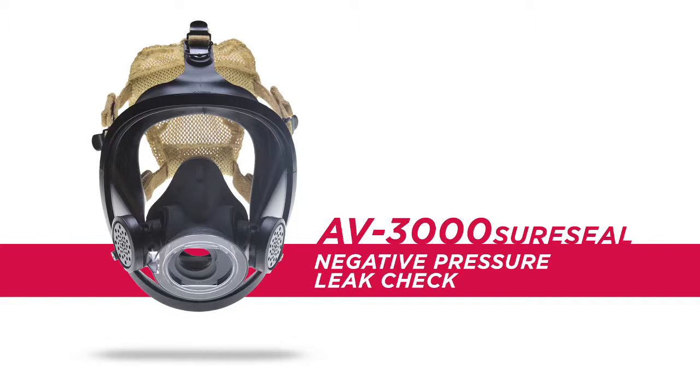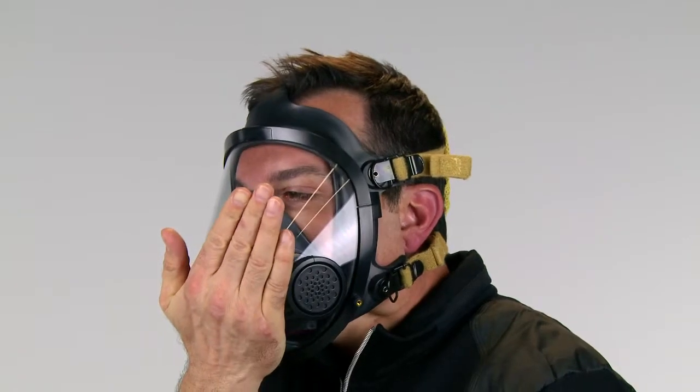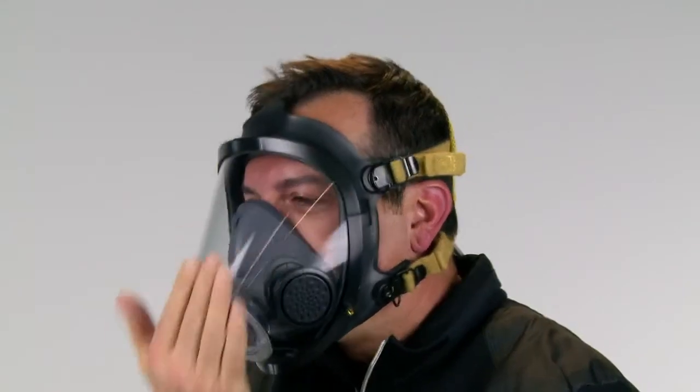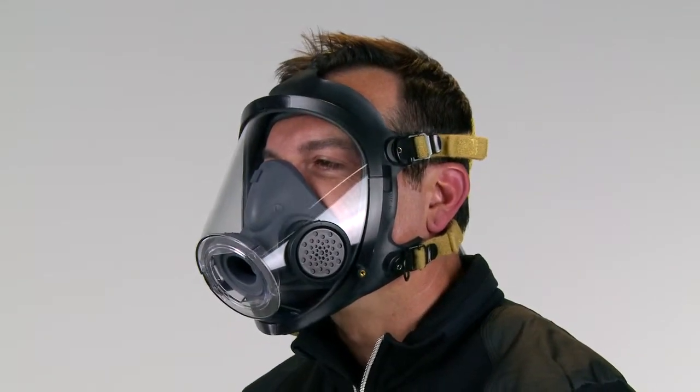Once the facepiece is donned, you are ready to perform the negative pressure leak check. Cover the front opening of the facepiece with your hand to stop ambient air from entering the facepiece. Inhale slightly and hold your breath to create suction. The facepiece will be pulled slightly toward the face. Hold breath for 5 to 10 seconds while checking for leakage.